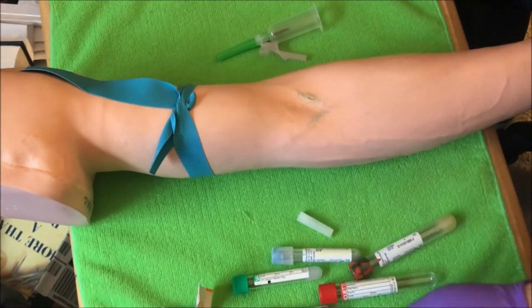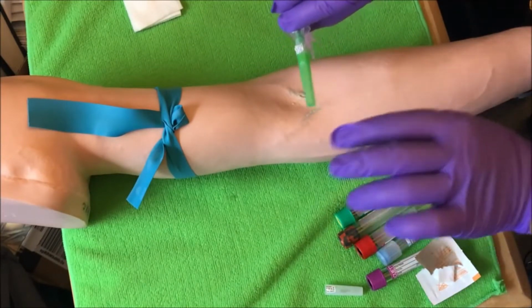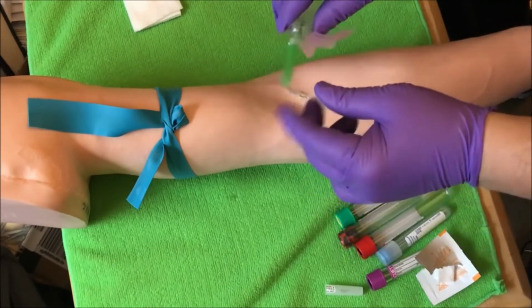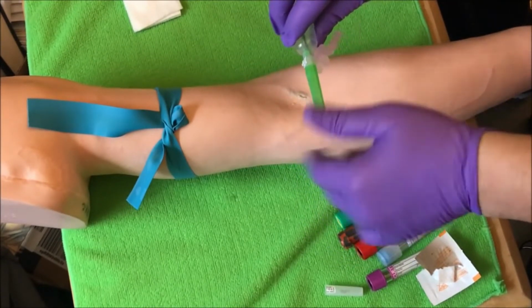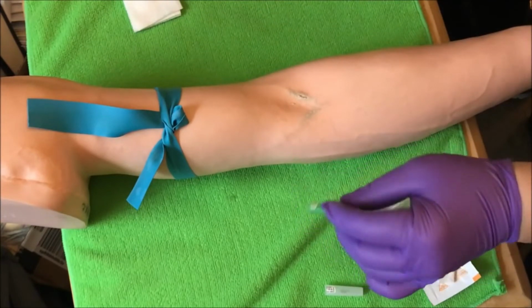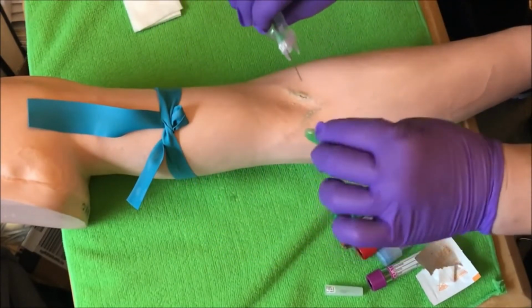Now, once you're ready to uncap the needle, and you're ready to go here, your 2 fingers and a thumb, basically you're going to turn your hand face down, palms down as usual, and I like to grip the cap of the needle, and I like to pull away. Try not to twist and pull, because if you twist and pull, you could actually take the needle and unscrew it. So palms down, grab the pink protective sheet, and pull away. This is the best way to retract without doing this. Do not pull away this way, and do not pull it towards you, simply aside and away.